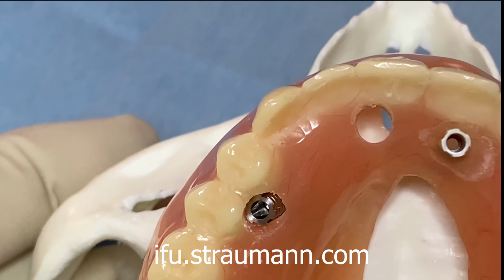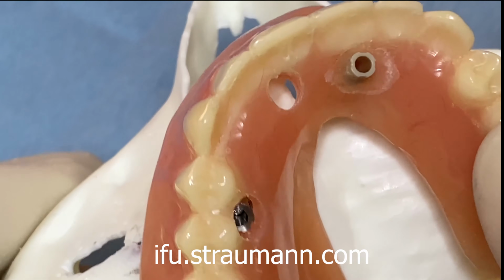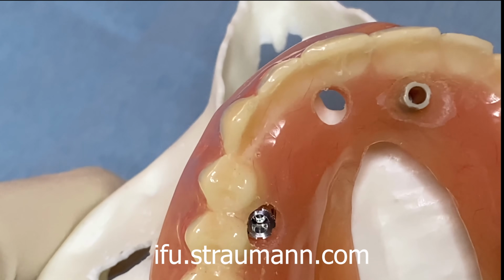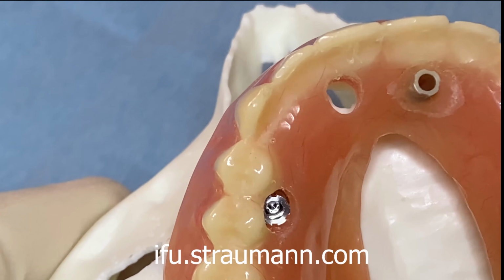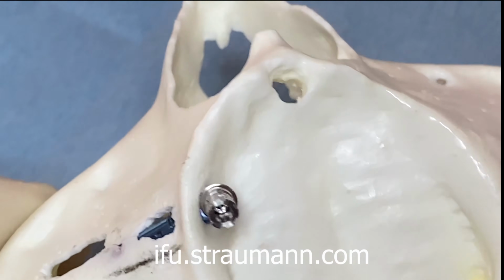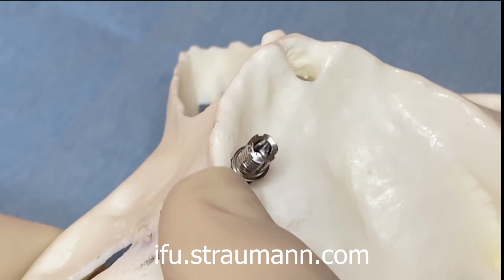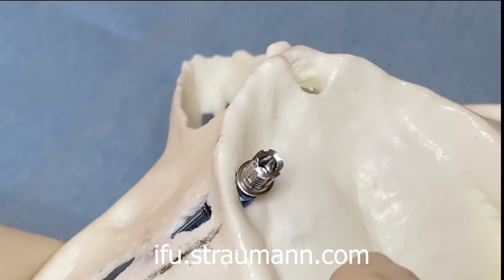One thing I'd like to point out, the screw access hole may not be coming exactly through the central fossa of the bicuspids. In order to do that, I would have had to move the implant platform more buccal, which would have gotten rid of the bone around the implant platform. This position of the screw access hole is absolutely no problem for the patients, and what it does is preserve all this bone that will allow for the peri-abutment soft tissue to settle down and seal the area from the subperiosteal region.